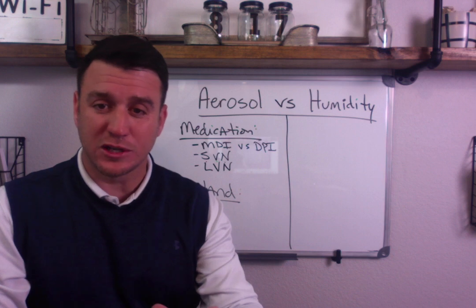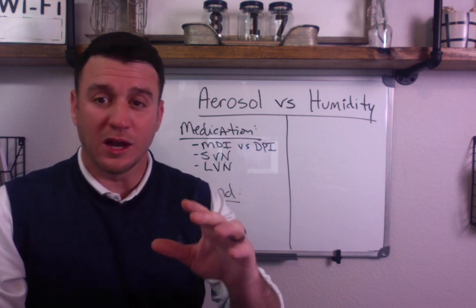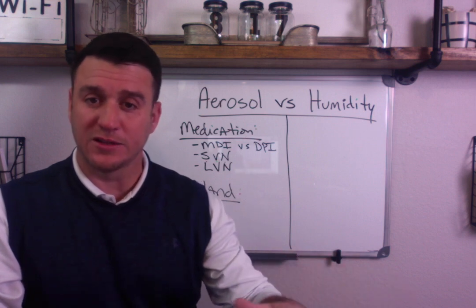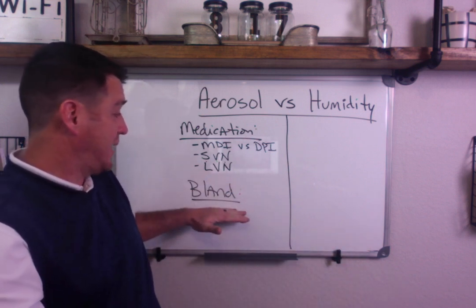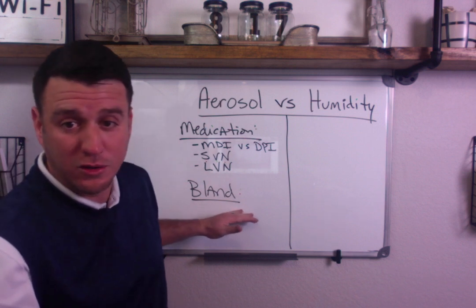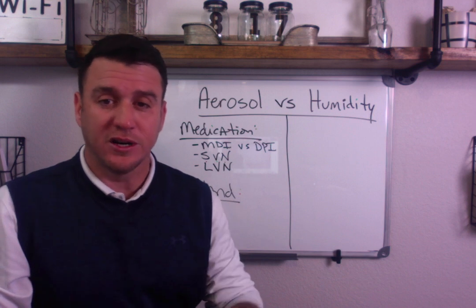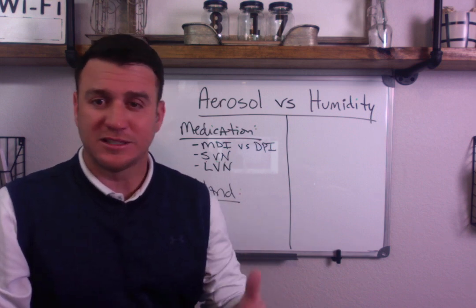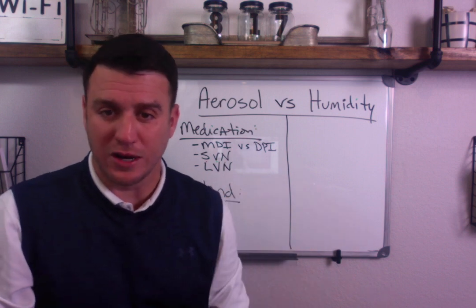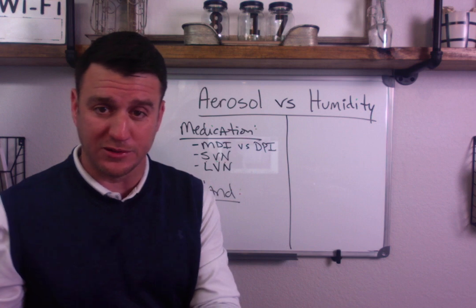Now, when I say large volume nebulizer, I want you to understand that a lot of times we can use those to deliver bland aerosol. So you're going to see large volume nebulizer come back in down here in bland aerosol also. But there's also a couple of devices that if you were wanting to give a continuous treatment to your patient, let's say 10 milligrams of albuterol, okay? Then you would use a large volume nebulizer to do so.